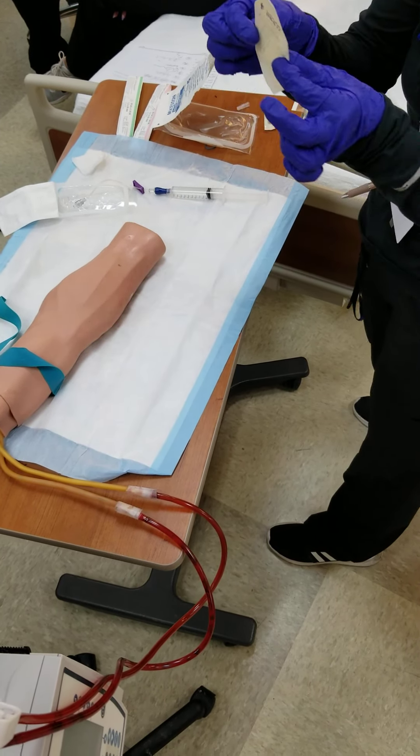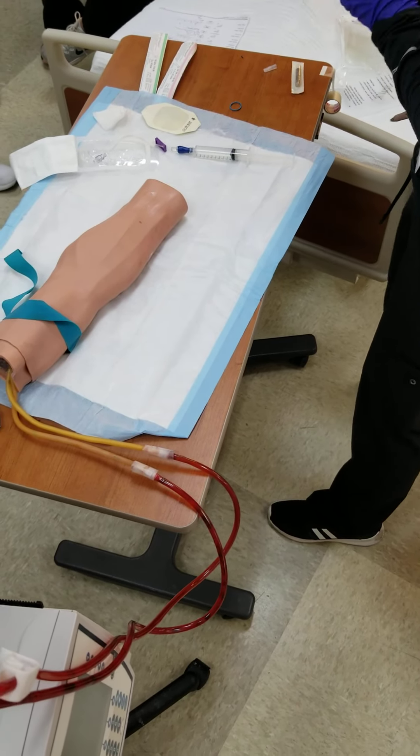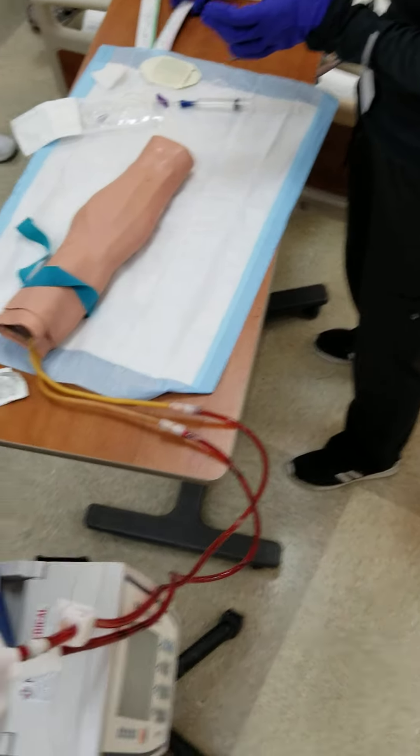And then the little label is there. And I'm going to use this one.